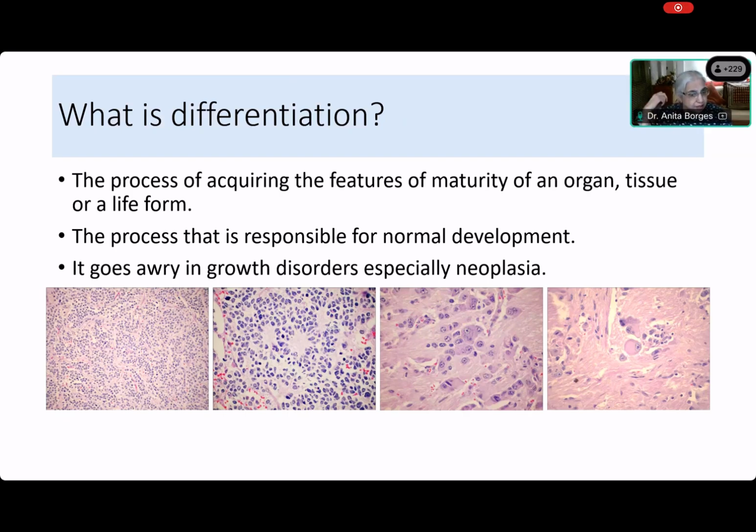Can anybody tell Lalit? Come on, Deepak. Tell Lalit why this is not a gland. I mean, he's now identified it as a rosette, but he can't tell me why he has changed from gland to rosette. So come on now, Deepak. Yes, ma'am. Why is it not a gland? Suppose you were in my place and you had to tell him why it is not a gland. What would you say? No, you can't. All right, let's ask Aishwarya. Aishwarya, first of all, do you think it's a gland? No, ma'am. Okay. So why?